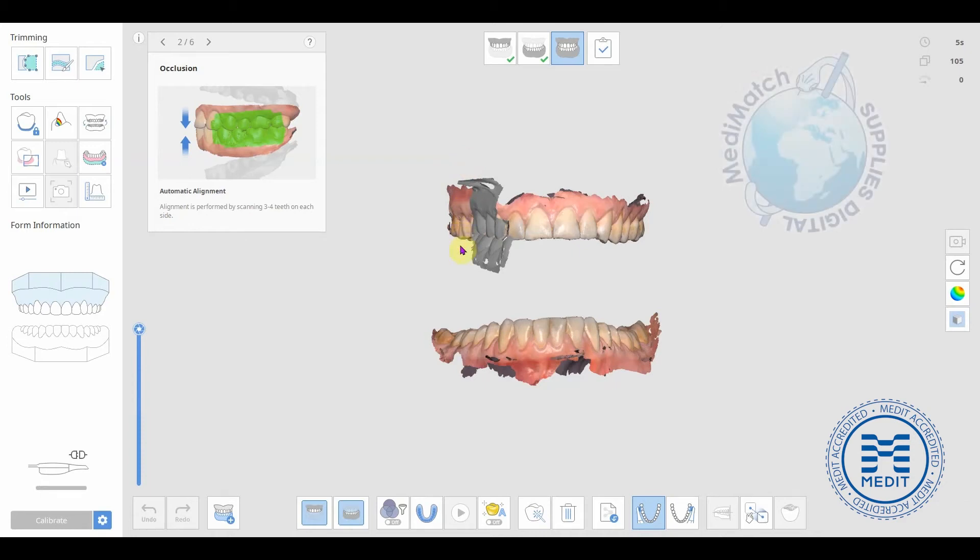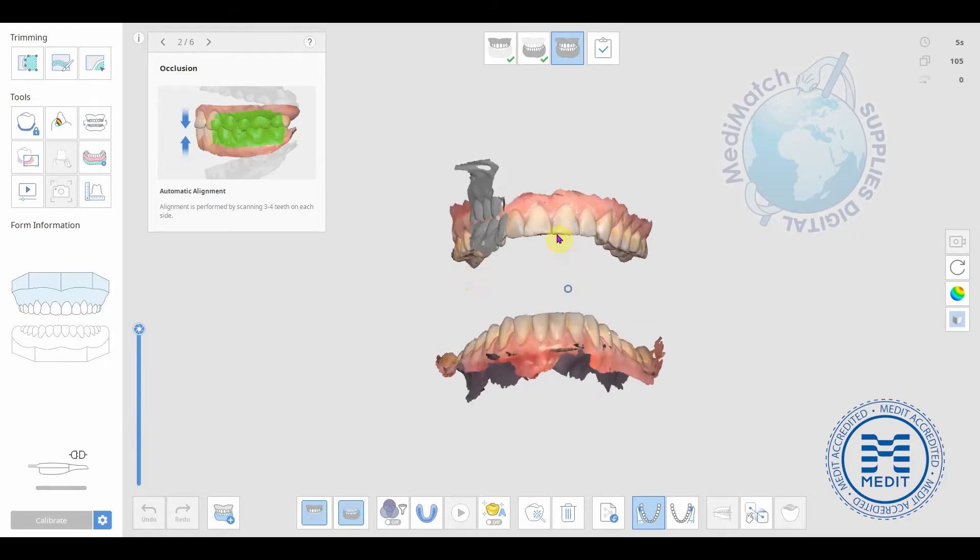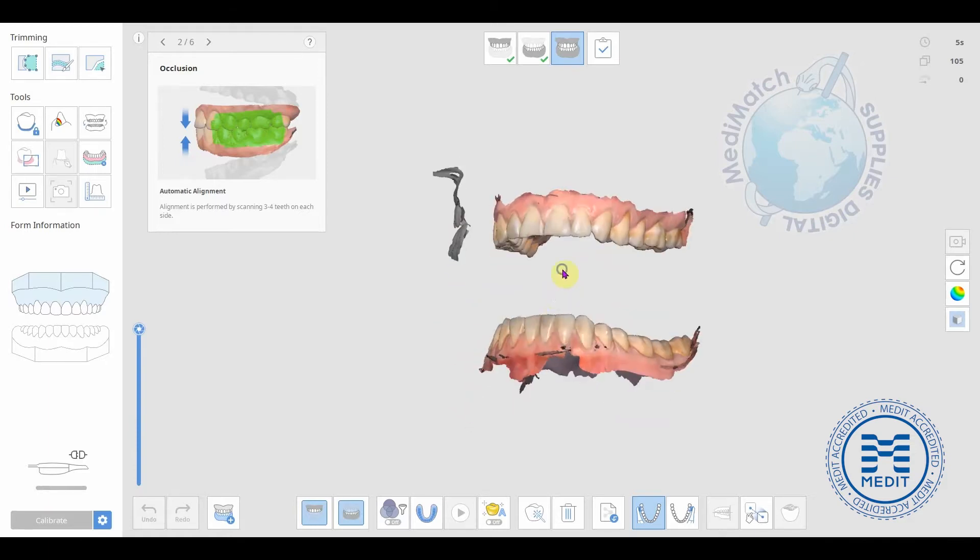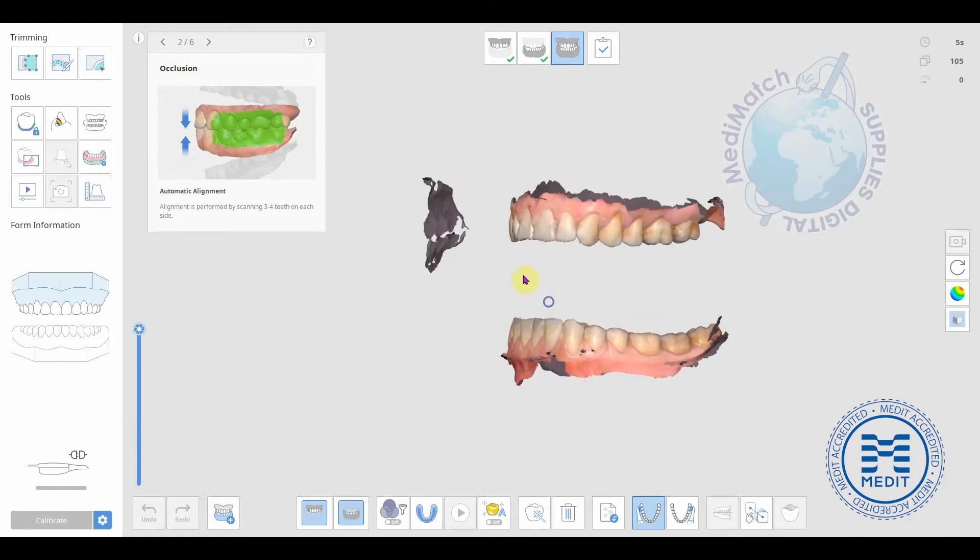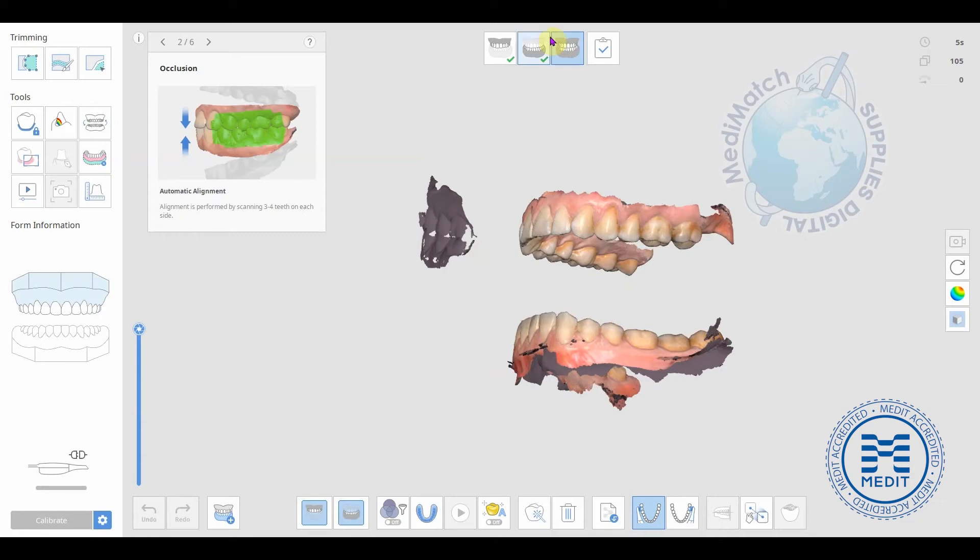Hi there, it's Dave from Medimatch. Just a short video here to show how to manually register the bite if the software fails to do it automatically during the bite registration stage up here.